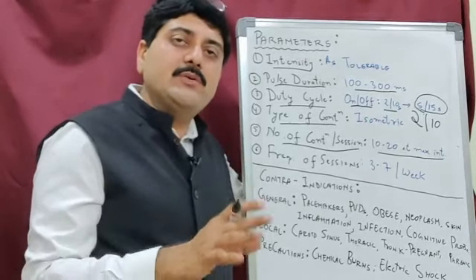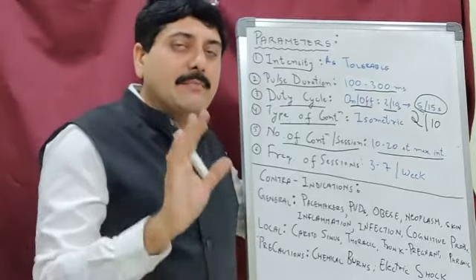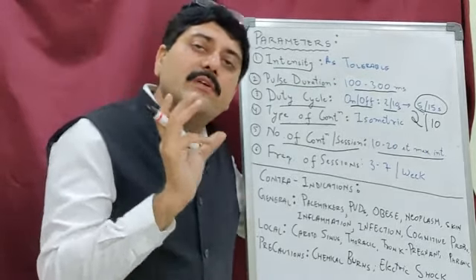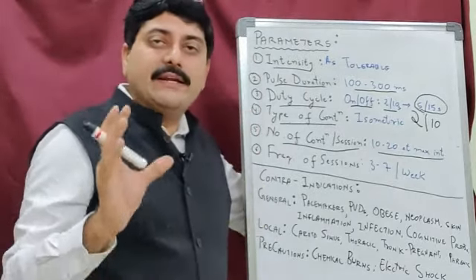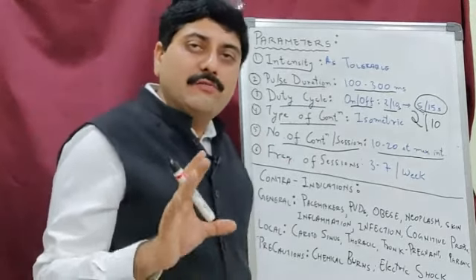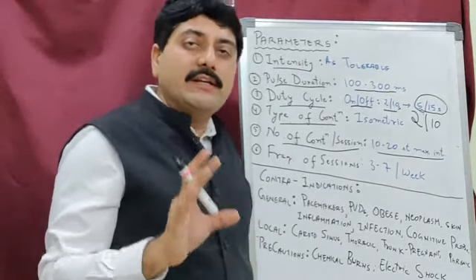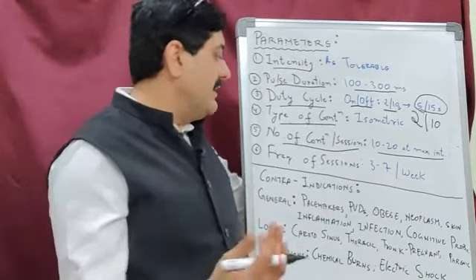Or if the patient is coming to you at the same time, you can go for 10 to 20 contractions with maximum tolerability, then give a rest phase and go for 2 to 3 cycles of 10 to 20 contractions. Please take care that the muscle is not getting fatigued and the quality of movement is not deteriorating, because if it deteriorates, then we are not going to get the desired results.